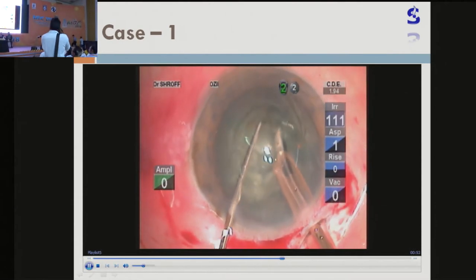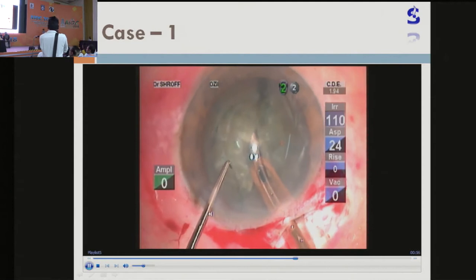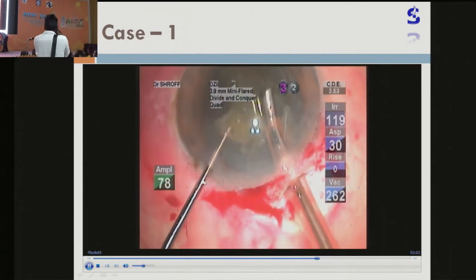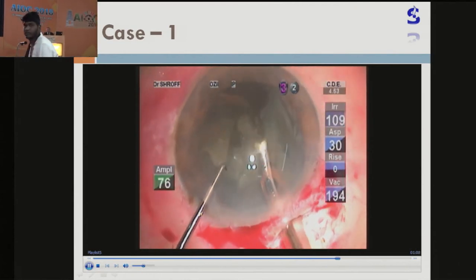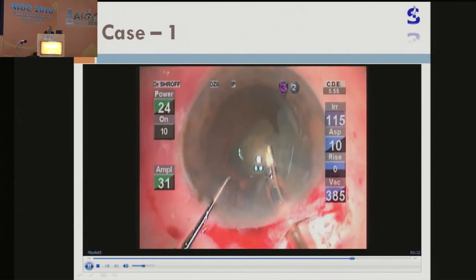And now, see — I am a little afraid to go to the periphery while chopping. Not as expert as Dr. Herman Salal, but here I would like to keep it straight, go right deep up to the deeper layers. And once the nucleus fragments are made, the nucleus fragments are brought out of the capsular bag and gradually one by one it is being emulsified.